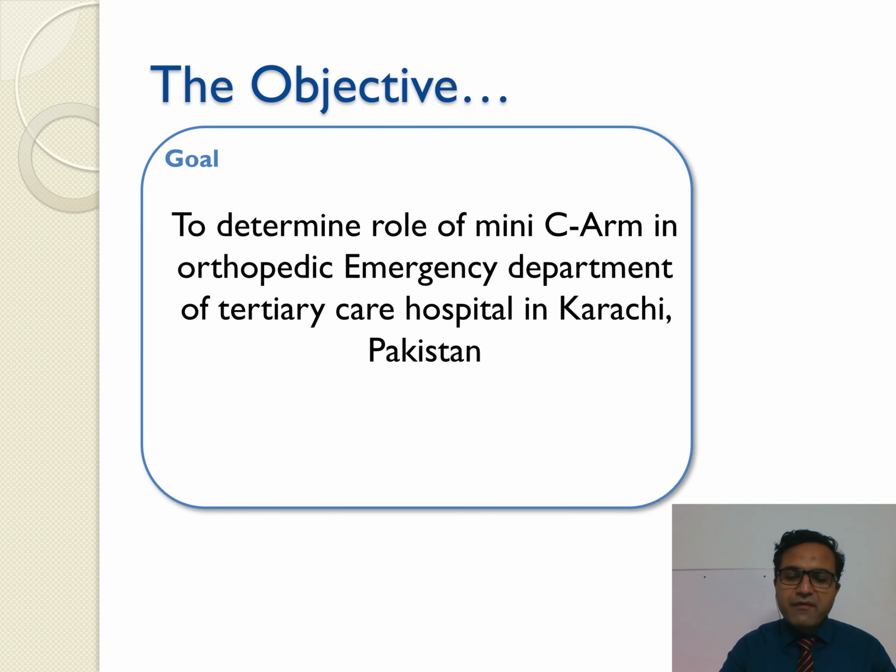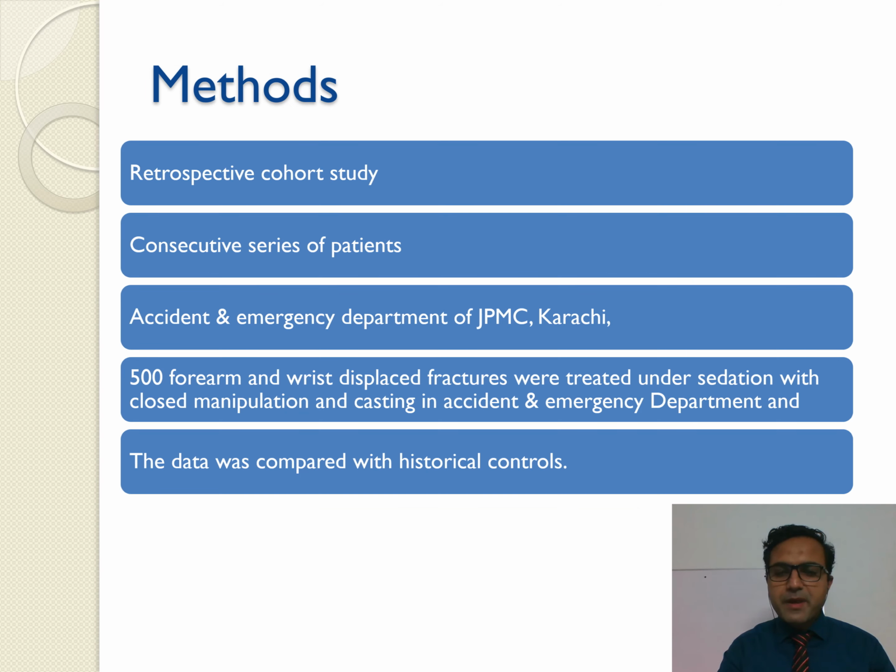So the objective of our study was to determine the role of the mini C-arm in the orthopedic emergency department of a tertiary care hospital of Karachi, Pakistan. It is a retrospective cohort study conducted on a consecutive series of patients in the accident and emergency department of Jinnah Postgraduate Medical Center, Karachi, Pakistan, which is the largest public sector tertiary care hospital of Pakistan. 500 forearm and wrist displaced fractures were treated under sedation with closed manipulation and casting in the accident and emergency department, and data was compared with the historical control.